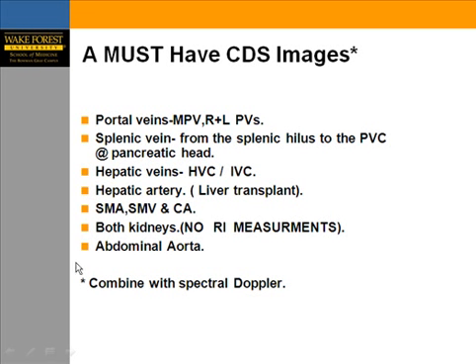The abdominal aorta, you also need to look at that so that you won't miss any potential silent aneurysms, specifically in elderly patients.